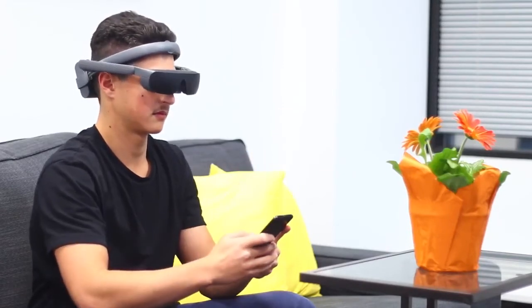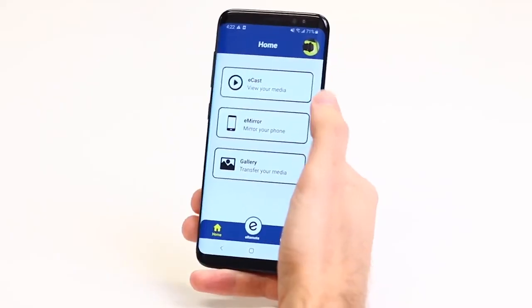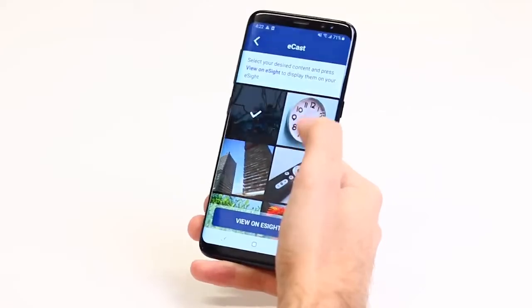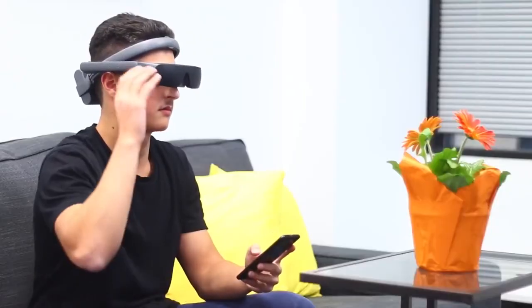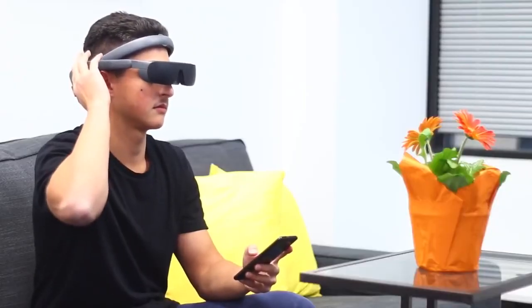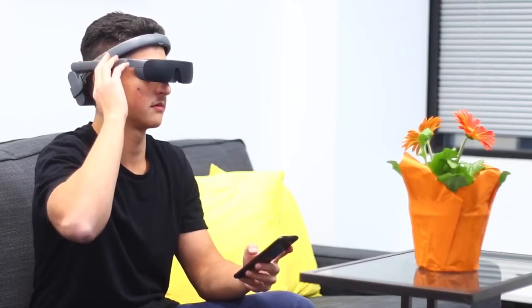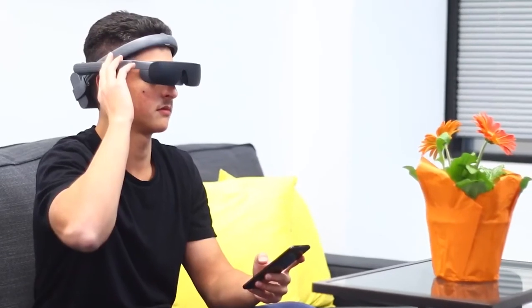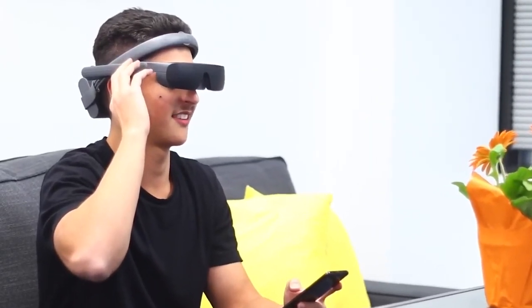Both eCast and eMirror simplify and improve the user's interactions with their mobile phone. With eCast, they can view photos or videos stored on their phone on their eSight and control the view using features like zoom. With eMirror, they can view what's on their phone screen, whether it's a website page or streaming video.